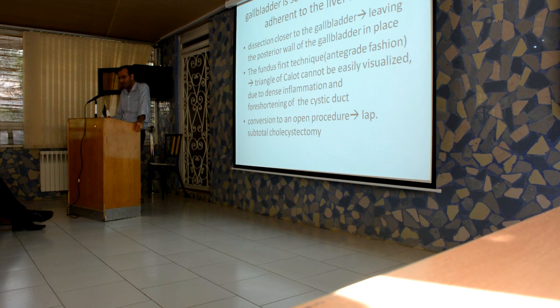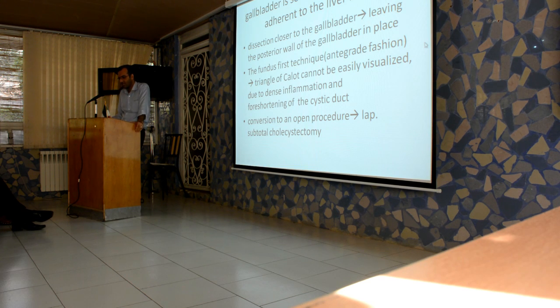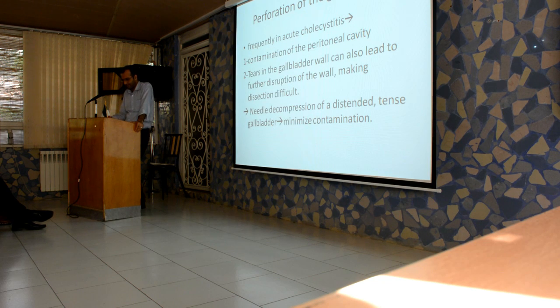If the triangle of Calot cannot be easily visualized due to dense inflammation, or the cystic duct is very short, conversion to open or laparoscopic subtotal cholecystectomy should be done in this case.